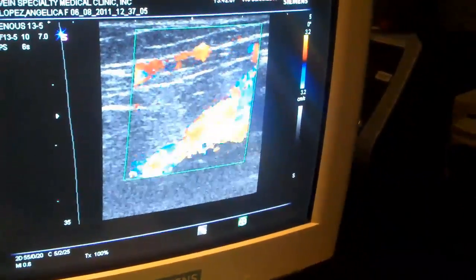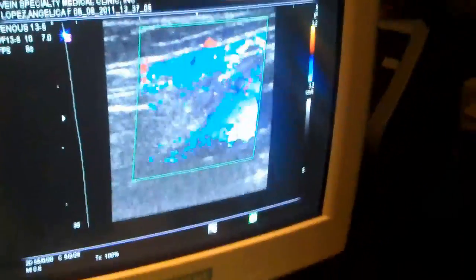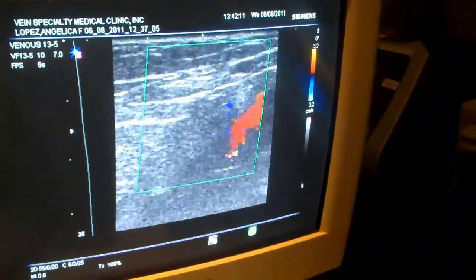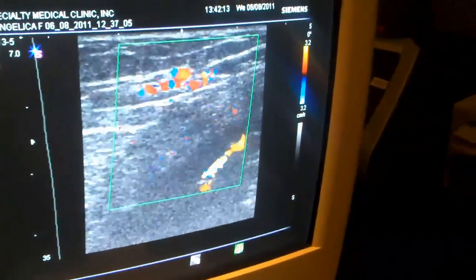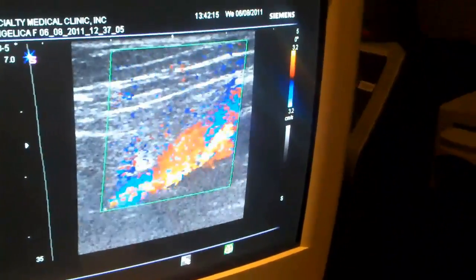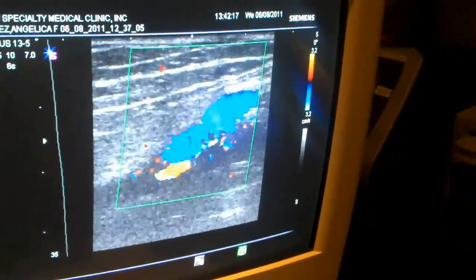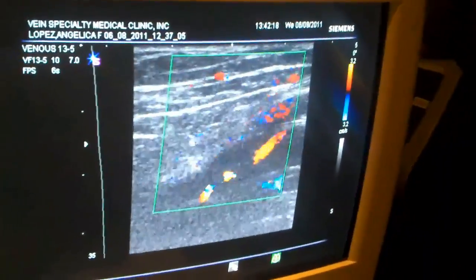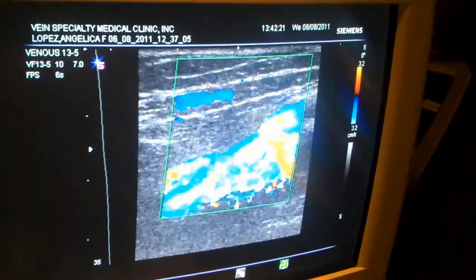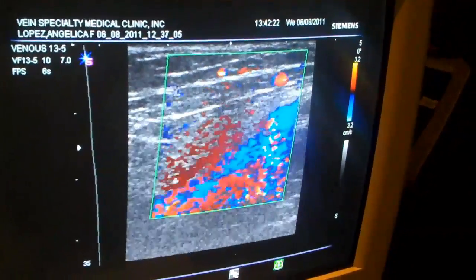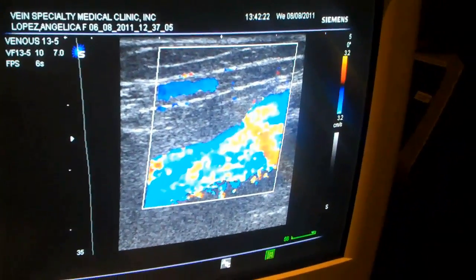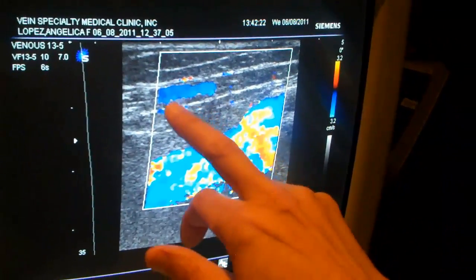First, let's check the short saphenous vein. The short saphenous vein on top is normal. There is a little accessory zigzag vein that goes parallel to the short saphenous vein, but that's not the short saphenous vein itself. The short saphenous vein — shown here as the blue vein — is normal. In her case, these are the gastrocnemius veins.